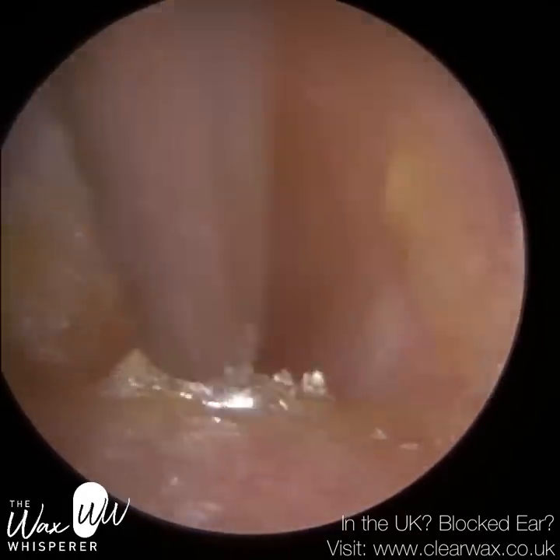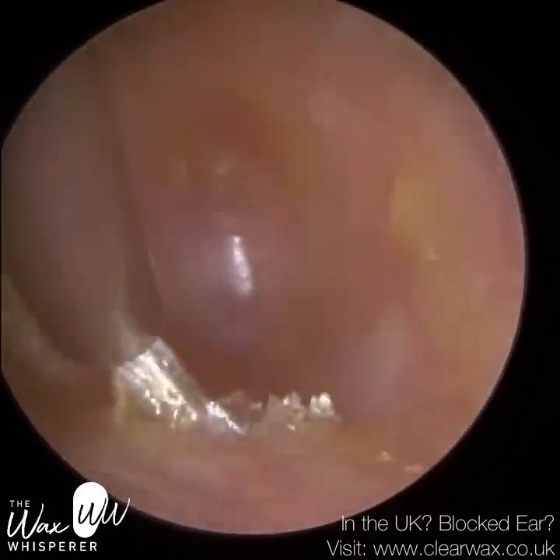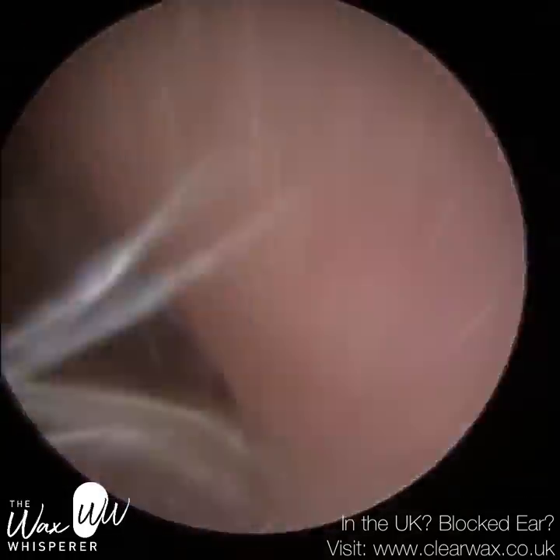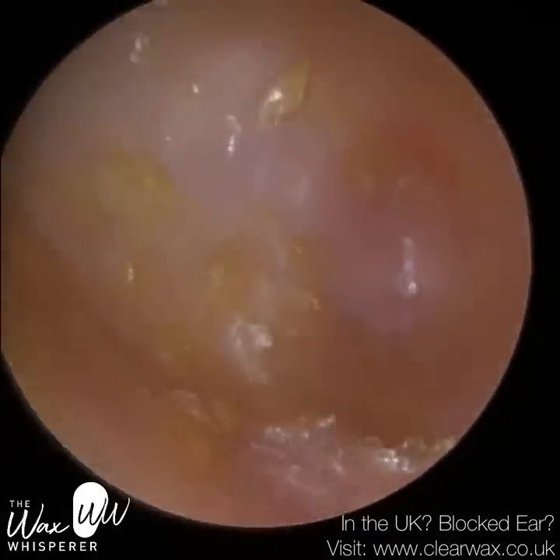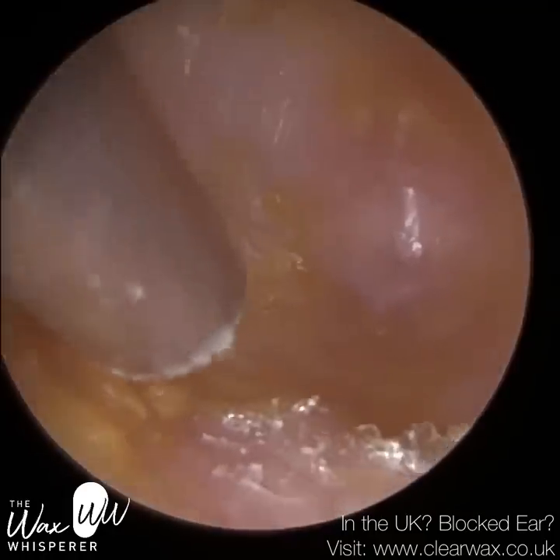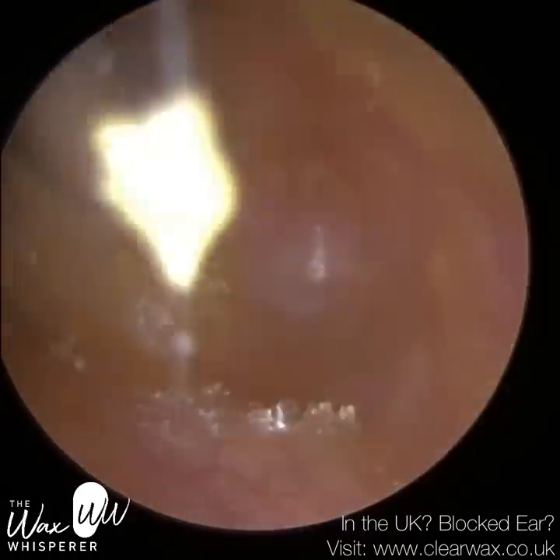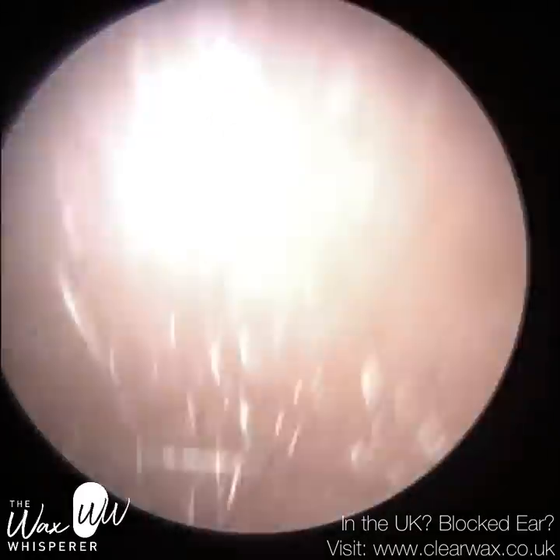Now, because of the strange anatomy of the ear canal, they do just get this buildup of dead skin. And the skin, you can see I'm just trying to peel it away. It lines the ear canal and it lines the surface of this false fundus. So we're just trying to remove as much as possible. Now, I've got to be careful that I don't make too much contact with this false fundus. I've seen it in the past where you can actually make an incision into that and it can bleed really, really badly. And so we don't want to be doing that. And I'm just trying to remove as much dead skin off its surface as possible.